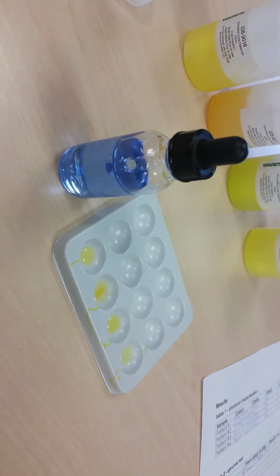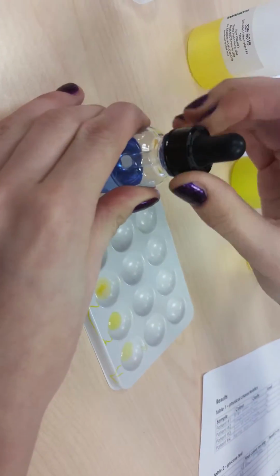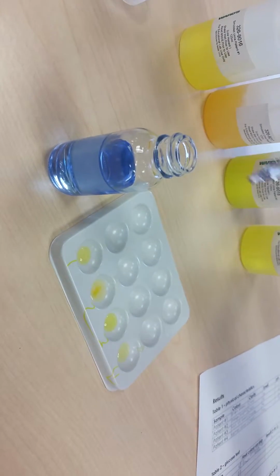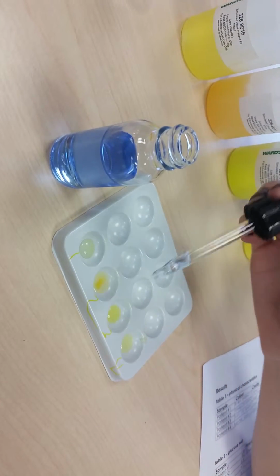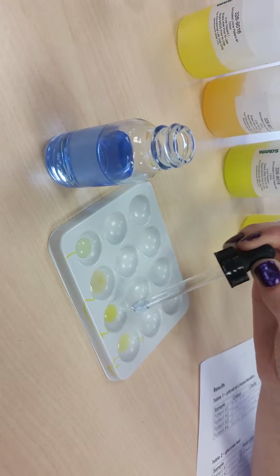So simply we're just going to add a couple drops to each one of these, and this is the reason why we're wearing goggles. It's a very corrosive solution. It has a high amount of sodium hydroxide in it, which would be the same ingredient you find in things like Drano. So you can imagine you don't want to get it on your skin, you don't want to get it in your eyes.